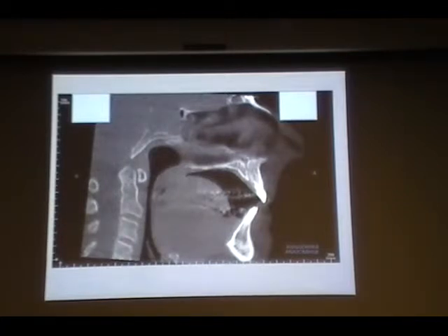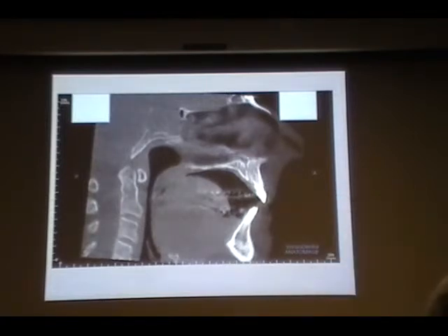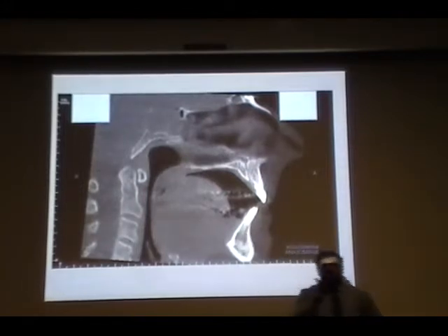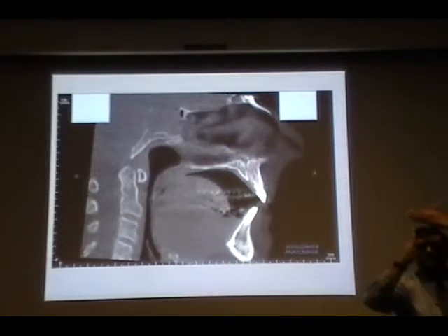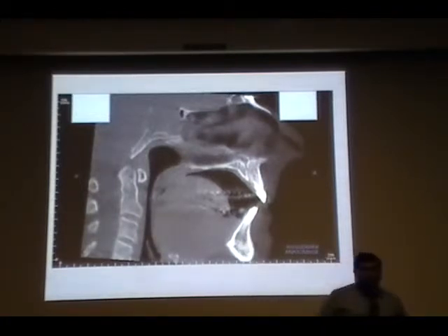Now, somebody pointed out that there is a lack of overjet and overbite. When you take a CBCT scan, we ask them to bite on the bite guide. Is this the ideal one? The answer would be no. And here you can see the tooth, and because of the slice, you are losing that transition. Sometimes the tooth may be in this plane, or if the tooth is like this in this plane, you are going to miss it because you have slices in a different fashion. So you're not able to see the tooth structure completely. That's why you're not able to see the root portion completely.